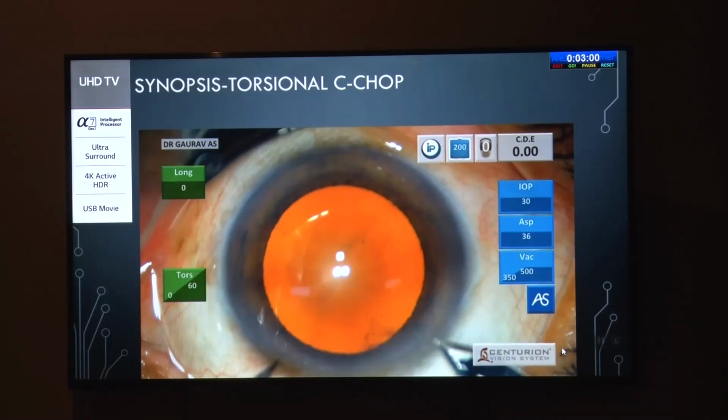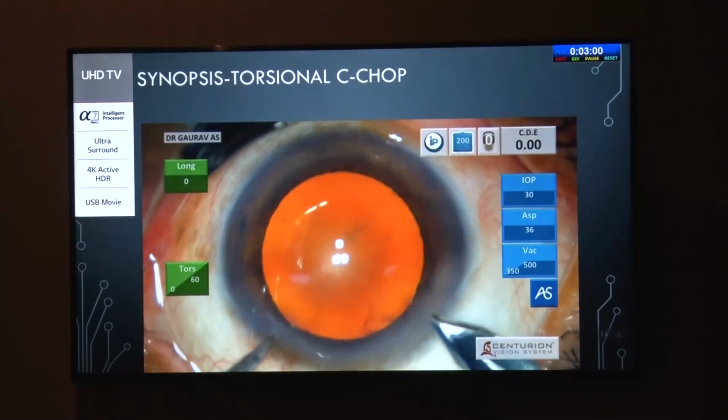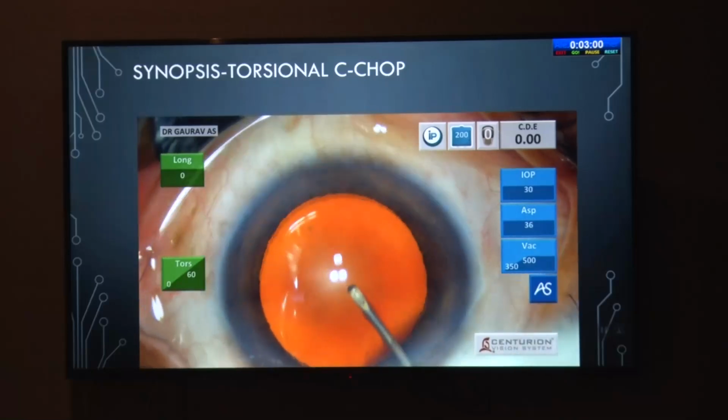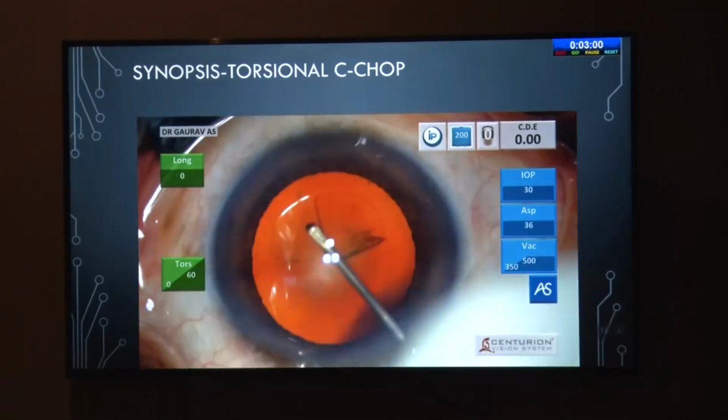Torsional V or C chop. It has got its own advantage, which in my experience is easier and can be done routinely on a daily basis. In this video, I will show you my incision technique, which is a 2-port incision, not a 3-port incision.